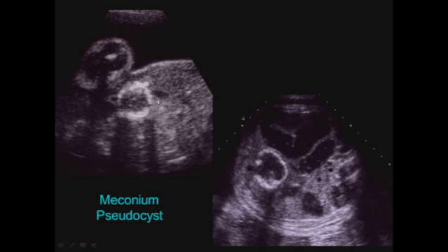In this instance, however, the meconium was walled off with the calcium in what is called a meconium pseudocyst. And it's clearly not a cyst. There's no through transmission, it's not anechoic, but it is round, and so it's gotten the name of the pseudocyst. And here's another example of this meconium pseudocyst. The chemical peritonitis has created a wall around the extruded meconium.